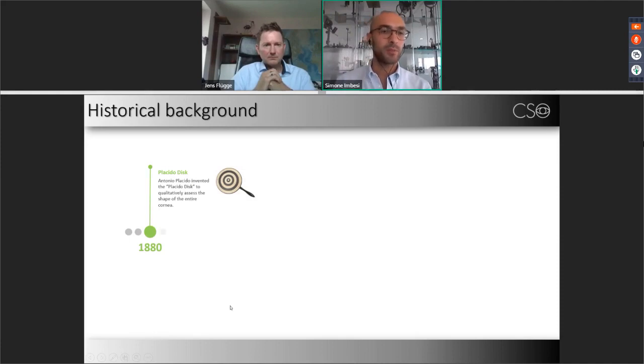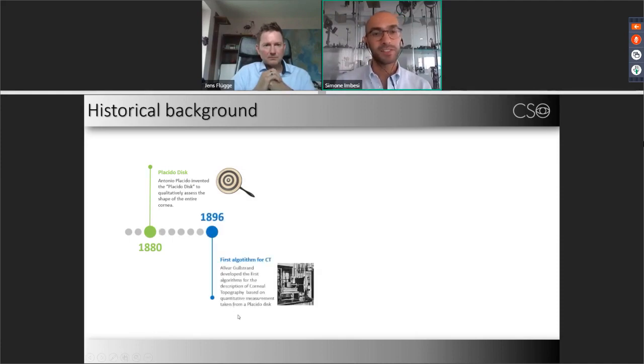Here I reported a brief timeline of the history of the Placido disc, from the first development in 1880.